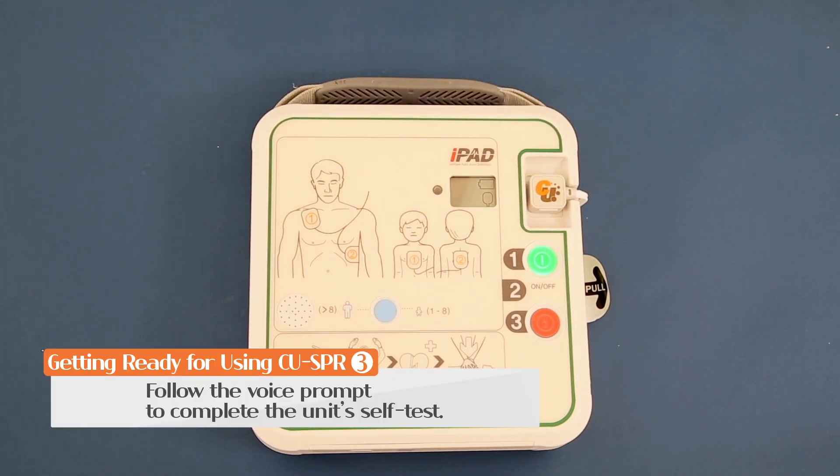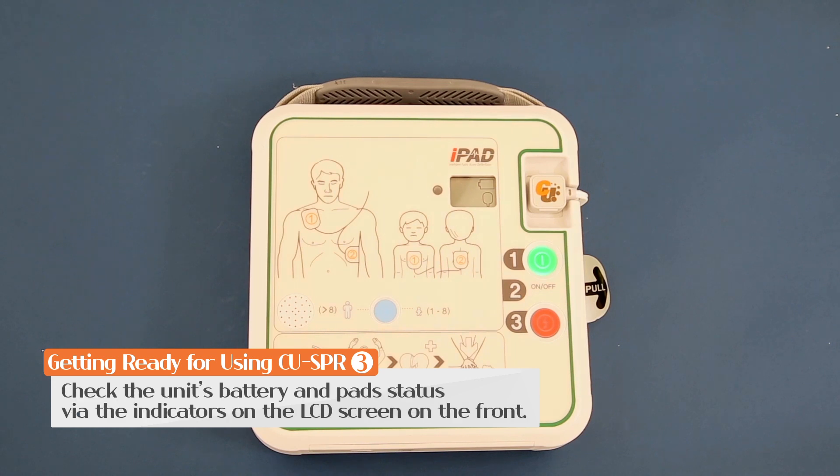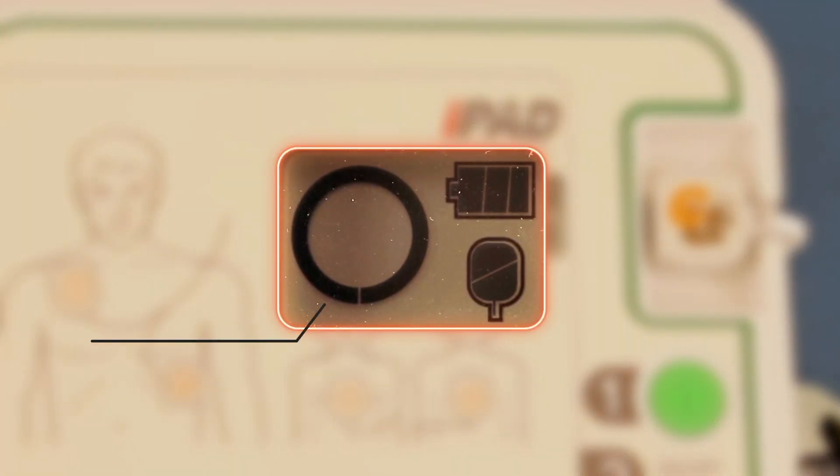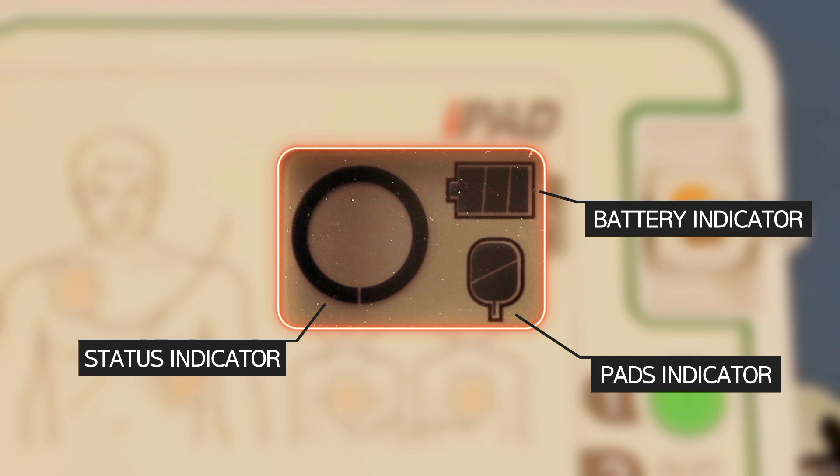Follow the voice prompt to proceed with the test. If no problems are detected, the battery and pad status will be indicated and a circle will appear on the LCD screen.